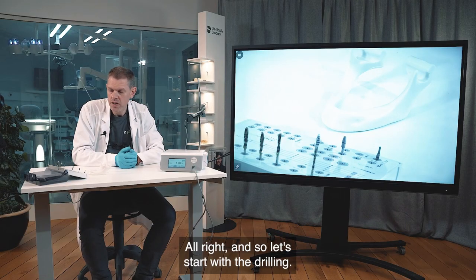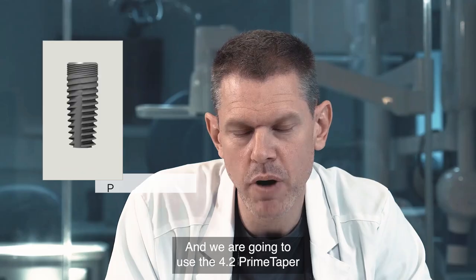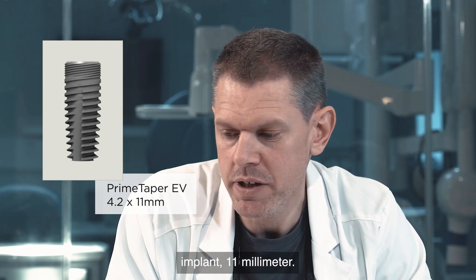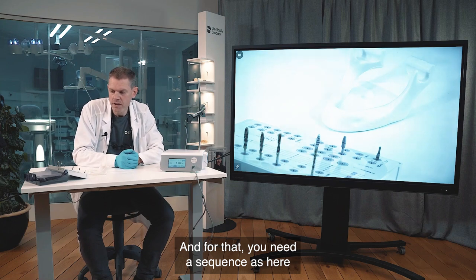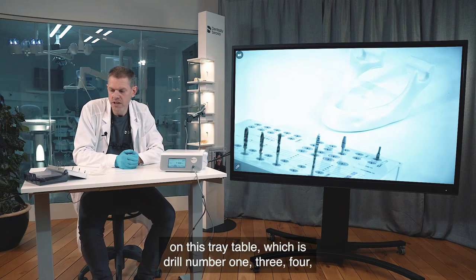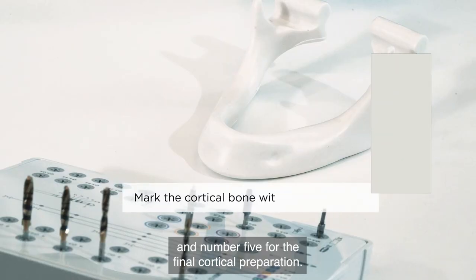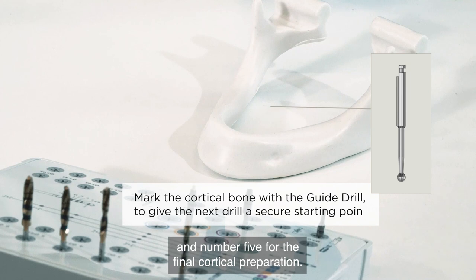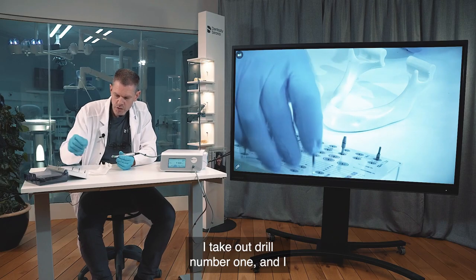Let's start with the drilling. We are going to use the 4.2 Prime Taper implant, 11 millimeter length. For that you need a sequence as shown on this tray table: drill number one, three, four, and final number five for the final cortical preparation.